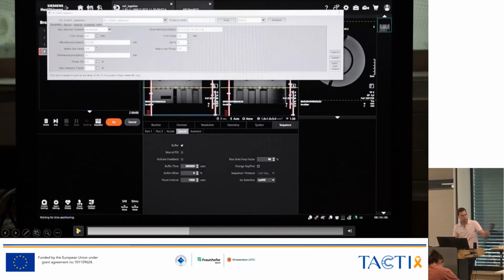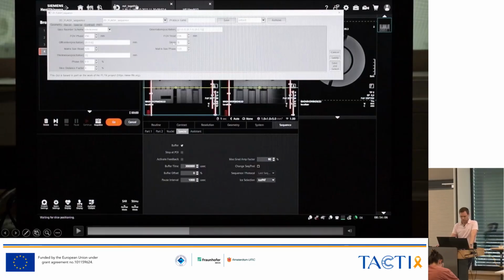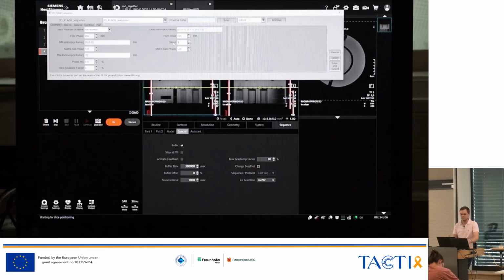that we have this little pop-up UI, because normally every MR sequence would be one vendor sequence. So you would drag and drop your different sequences into this protocol queue. But in our case, we only have one sequence driver, which is able to communicate with our gammaSTAR backend. And then we can use this driver to select all the different sequences, all the different parameters. So it's basically just a connection to our whole gammaSTAR backend.